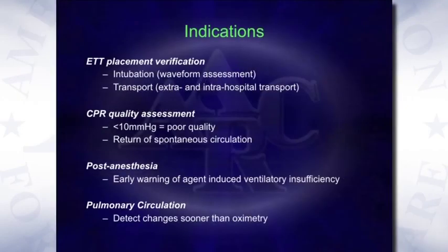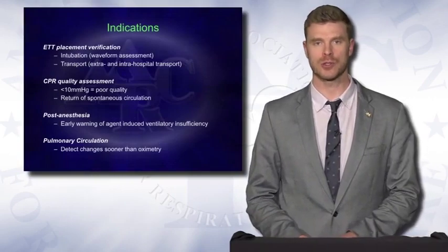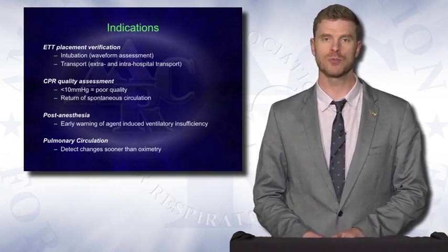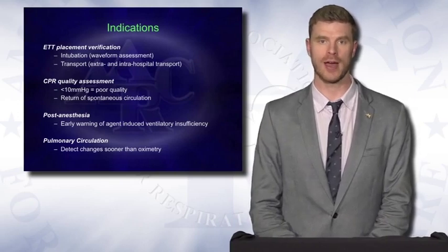Indications for CO2 monitoring. I think the first thing that you'll appreciate by looking at this slide is the list is actually pretty small. What I've attempted to do is look at the literature and summarize for you what I think are the most strong recommendations over the last couple decades of literature in the neonatal and pediatric population for using CO2 monitoring. Endotracheal tube placement verification. There's a lot of good data in the neonatal and pediatric literature that supports using CO2 monitoring to verify that the endotracheal tube is in the correct place down the respiratory tract.